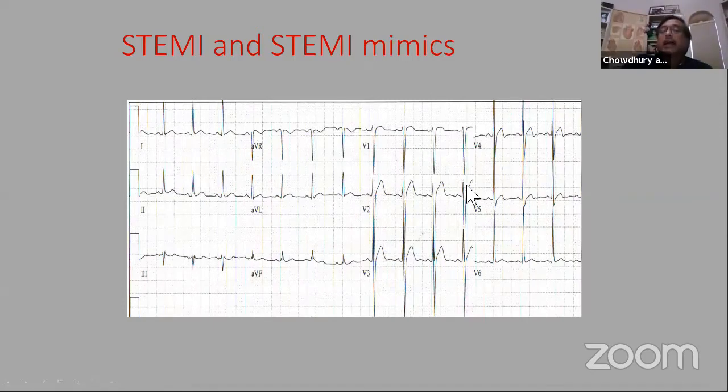But for this patient, I gave you a clinical picture. The clinical picture was not MI, right? A little bit of chest pain, not feeling well, board meeting, and the clinical picture is not fitting well, and the EKG is LVH, not fitting well. This is a classic example of doubtful plus doubtful is more doubtful. So now, is there any way we can conclusively tell that this is not STEMI?